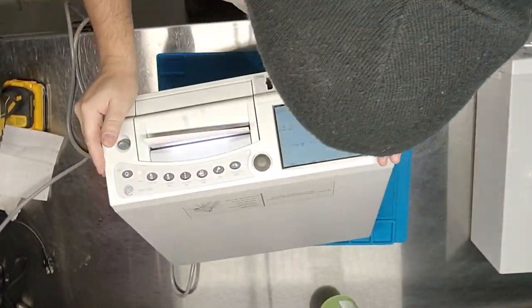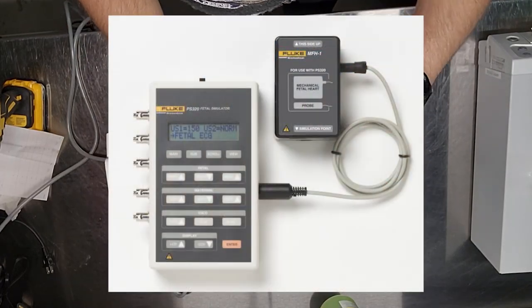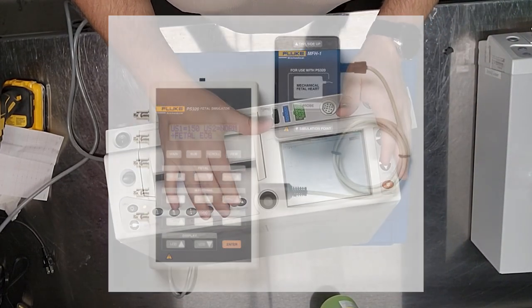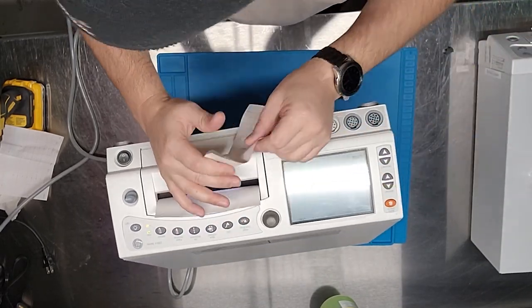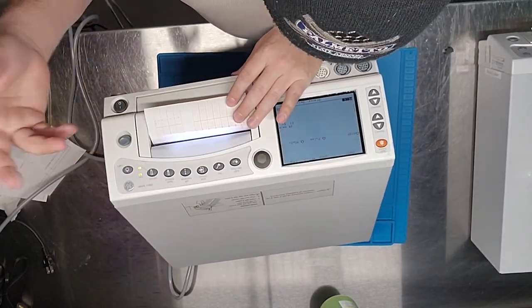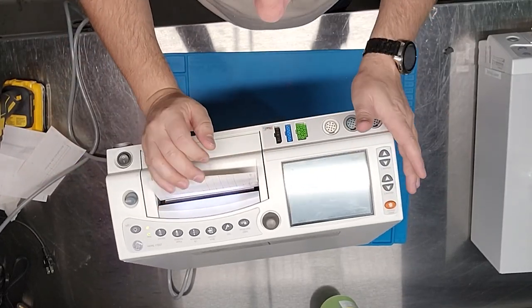There is a Fluke fetal simulator you connect to this unit to fully test it, but they're exceptionally rare and mine is currently out in the field for December PMs. That's why these monitors are sitting here — before releasing them back to customers after repair, they get connected to a fetal simulator and we run through all the parameters.